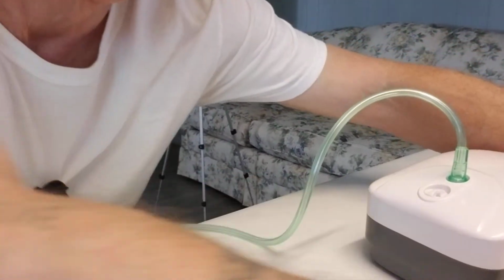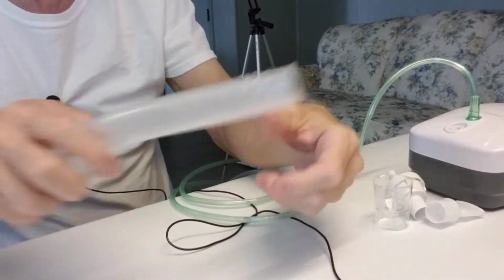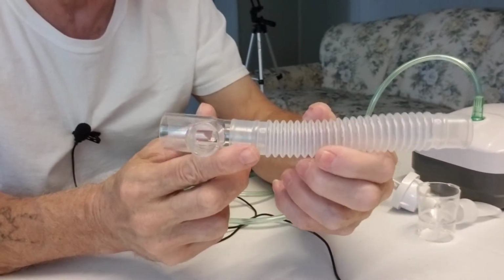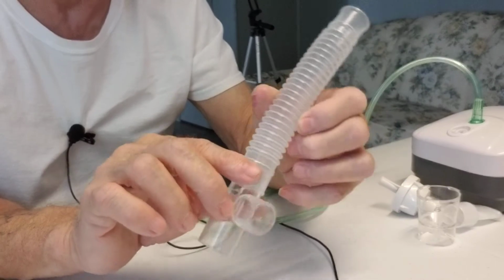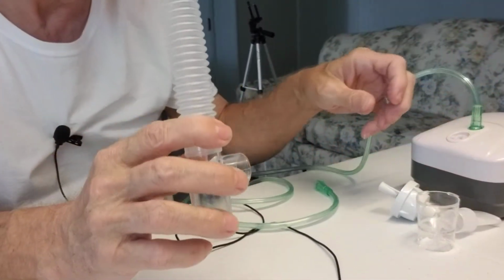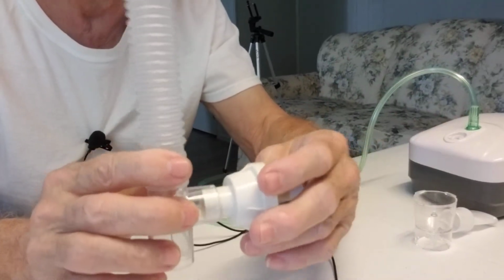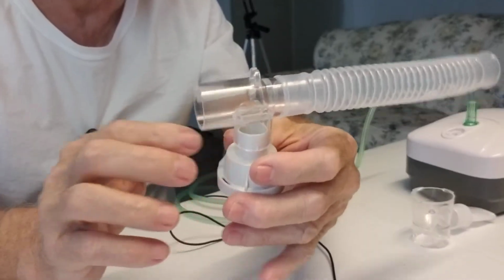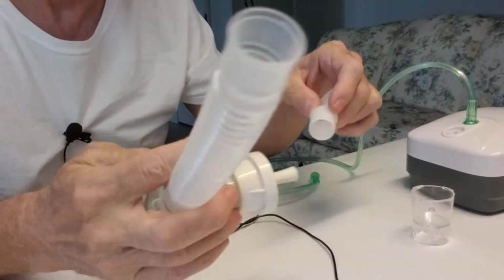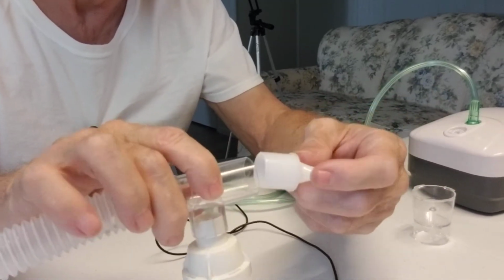Well, actually, all of the parts that come with this. Okay, let me move the camera back a little bit. Here is the main tube. As you see, this piece has a connector right here. If you were to connect these in order to use them, you would connect this piece to the tube. Just connect it firmly so it doesn't leak. Next, you're going to connect your mouthpiece to your tube.